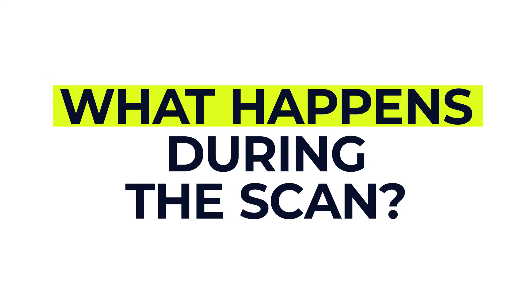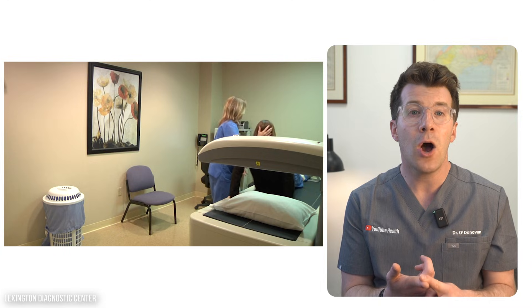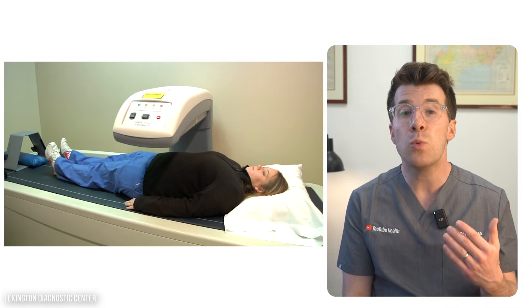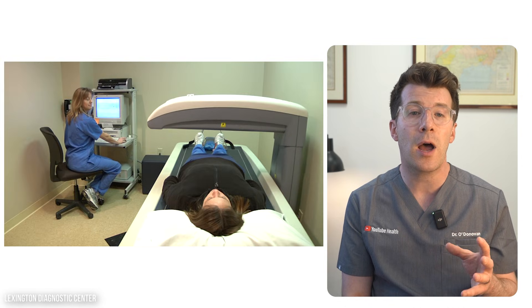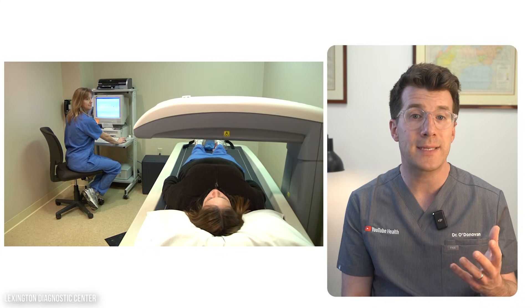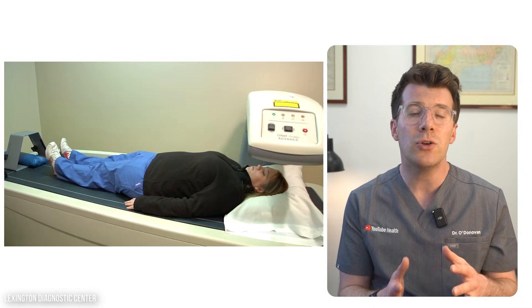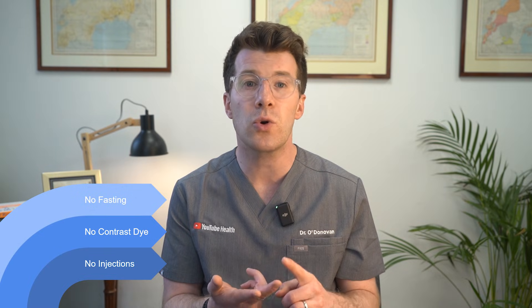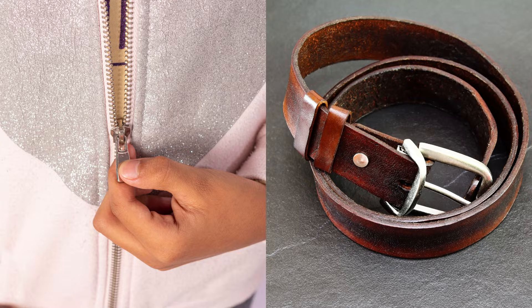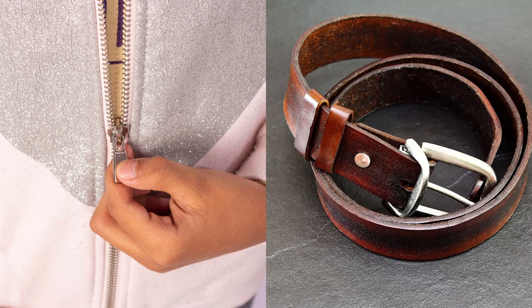So what happens during a DEXA scan? It's actually a very straightforward process. You'll be asked to lie on your back on a flat x-ray table, and a large scanning arm will slowly pass over your body. You'll usually be scanned at the hip and the lower spine, but sometimes the forearm is scanned too, especially if a spine or hip scan isn't possible. You'll need to lie very still for the scan, which usually takes 10 to 20 minutes. No injections or contrast dye are used and there's no need to fast beforehand. You may be able to stay fully dressed, but you'll need to remove clothes with metal fasteners like zips or buckles. You can typically go home immediately after the scan and carry on with your usual activities.